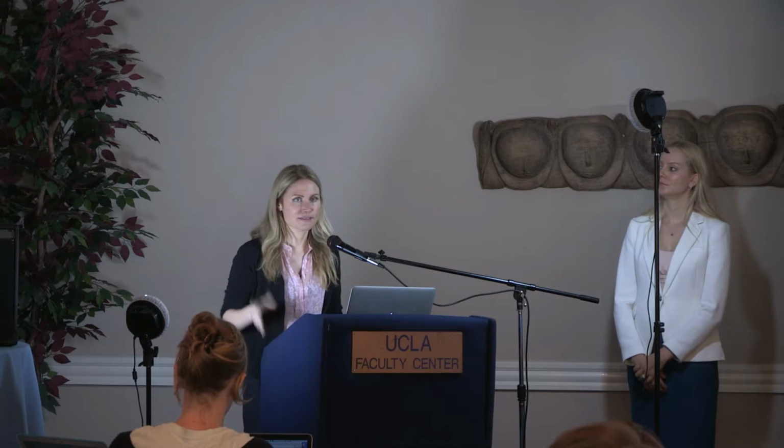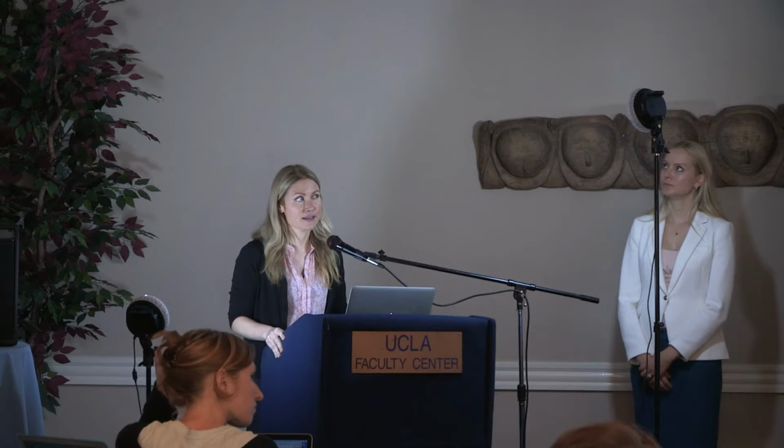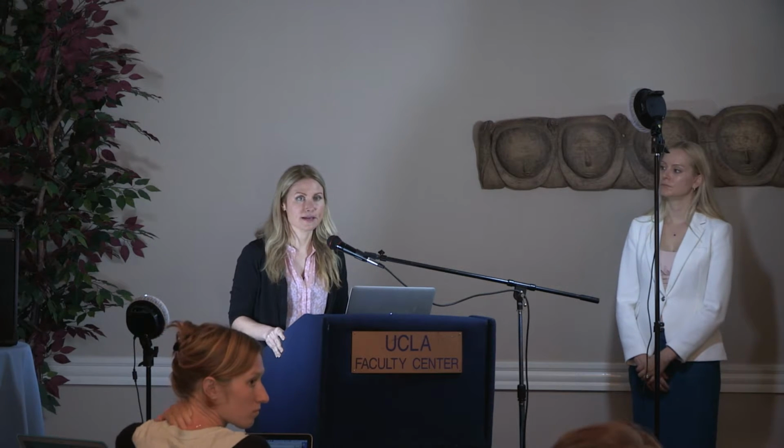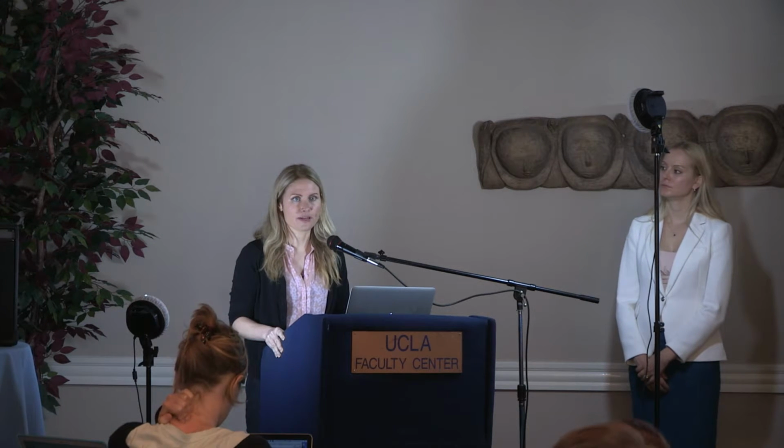So one of the toolboxes that I've used for this is OpenMEEG. There's a nice paper by Alex Gramfort describing how the sources are modeled and propagated in this forward model. So then the reverse part of it, there's a lot of different algorithms for that. There's beamformer, there's all different types of models. With DCM, I think it's a paper by Matut, maybe 2009, I think they're still using that version. But there's a lot of different ways of choosing the sources as well.